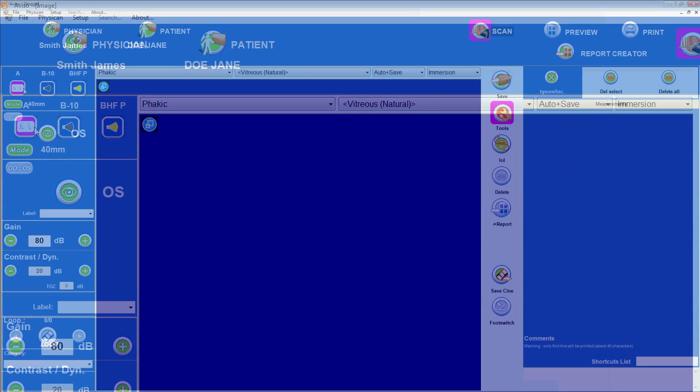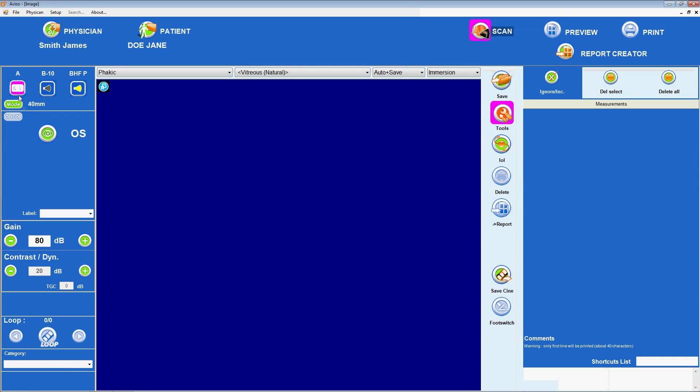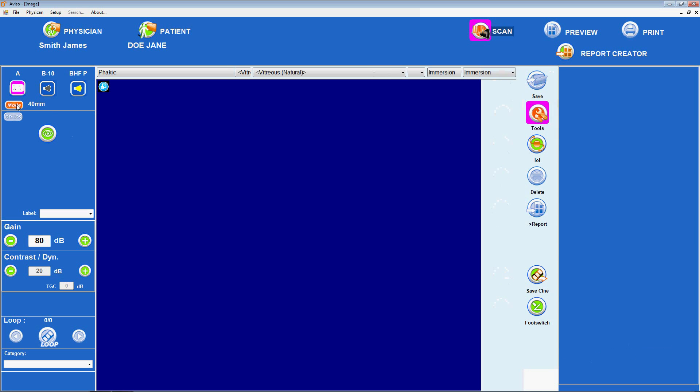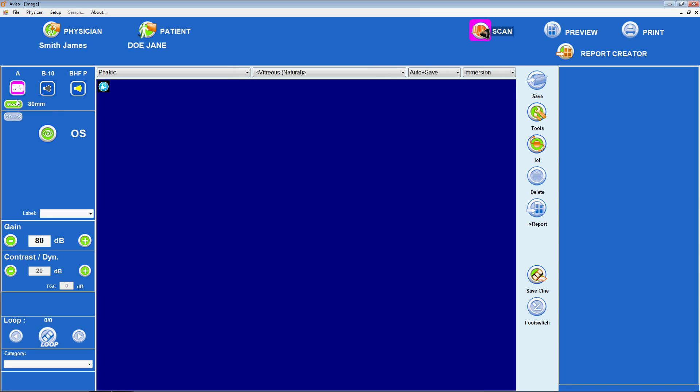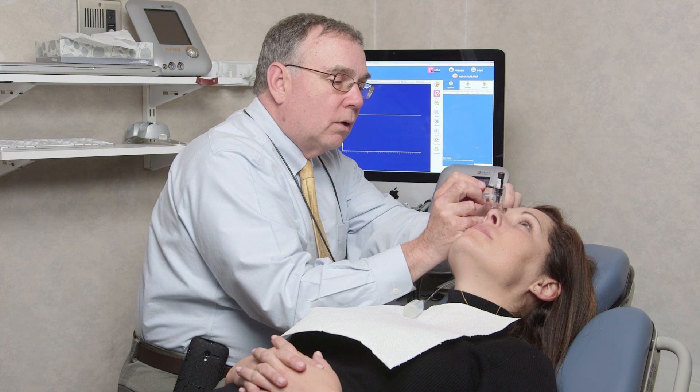From the A-scan biometry screen, the examiner can select the parameters appropriate to a given patient. The type of probe. We'll choose the standard biometry probe. Eye type, whether the patient's eye is phacic, aphacic, or pseudophacic, plus the IOL material.